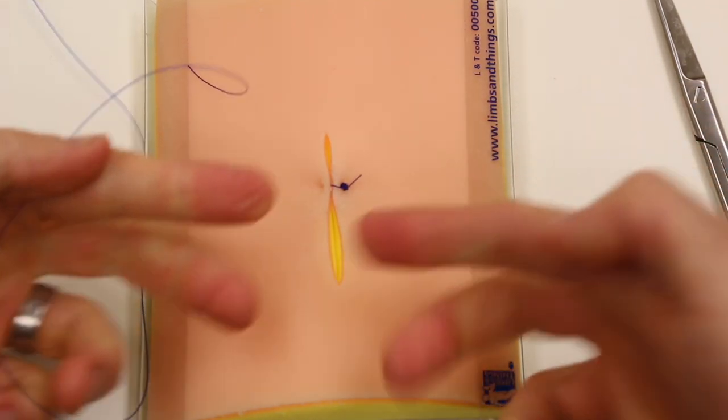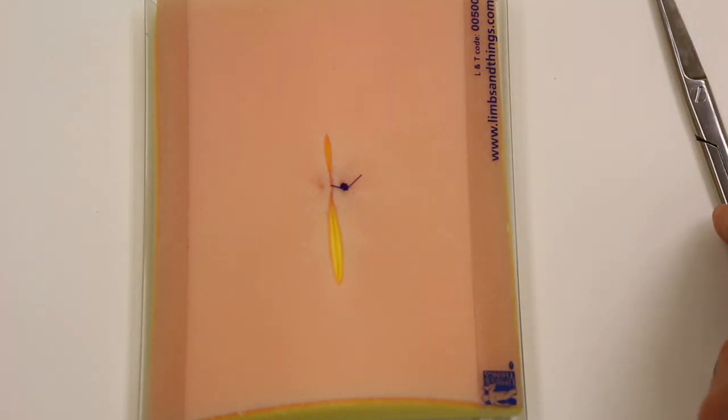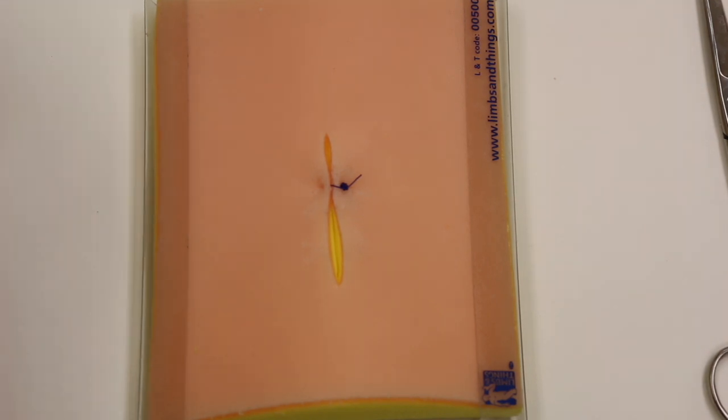And since you have two full strands going both ways for each knot, the incision is fairly well supported. Kind of divide tension between there. Unlikely to tear.